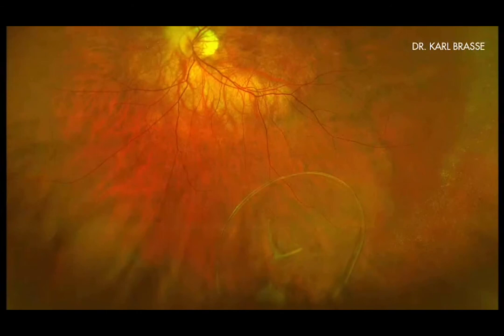Finally, I will get to talk about the Group 5 in my floater classification. It is basically a dump for whatever vitreous opacity is left that does not fit into the histoanatomical classification. This is spectacular image of a sunken capsular tension ring. These days you see frequently silicon oil bubbles. Silicon oil is used as a lubricant for syringes used for intravitreal injections.